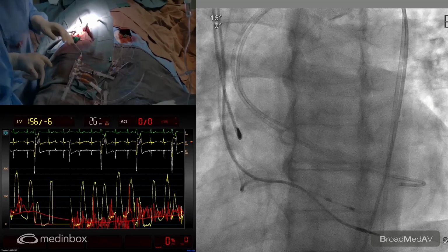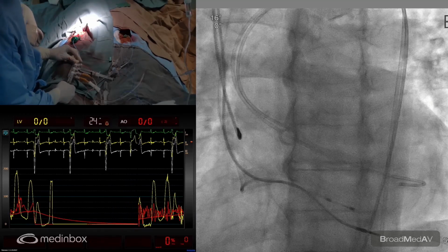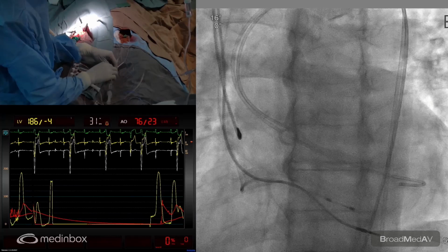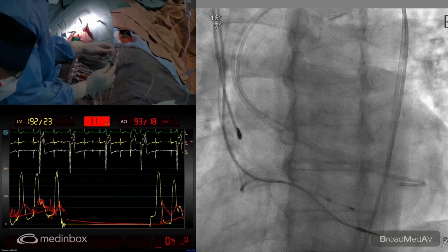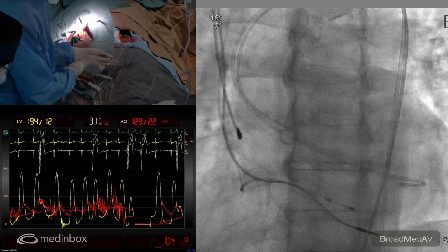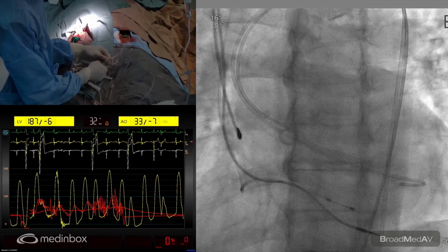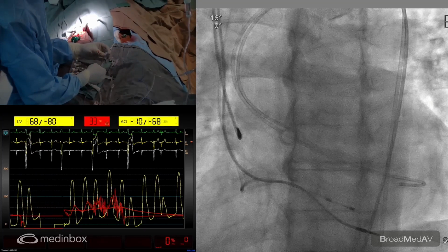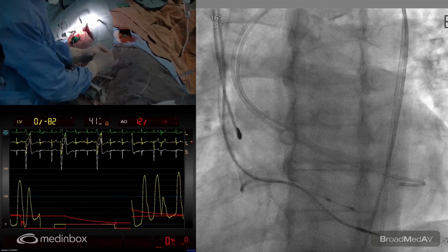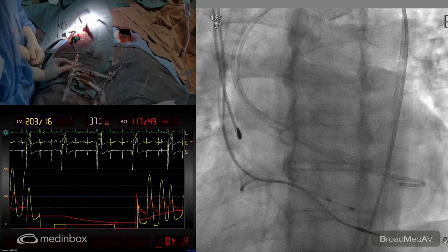Flush this. Flush both. ACT is 592. Flush which one? Red or blue? Okay, ready? We're now going to get some gradients here and then, after that, go ahead with the pre-dilatation. So if you can show the hemodynamics.